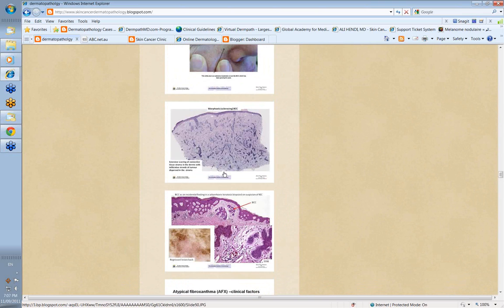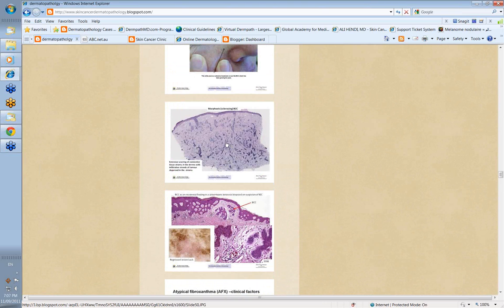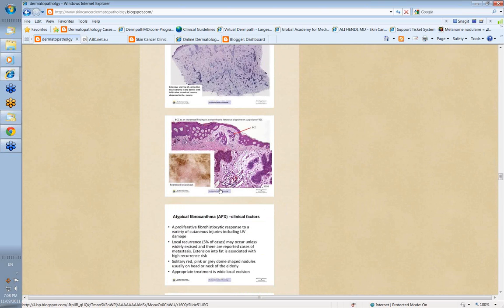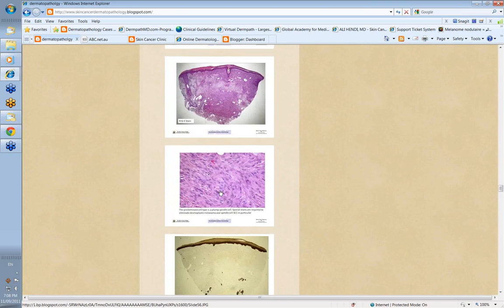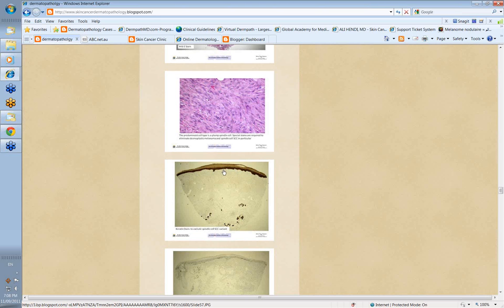Now, you can see this is an infiltrating BCC, a morpheic BCC. I'll deal in quite some detail with clinical images and what you can infer from them. But this is the infiltrating picture you see in an infiltrating BCC. Little bits of atypical fibroxanthomas, some special stains that are done sometimes to show keratin in the stratum corneum and in the epidermis here.